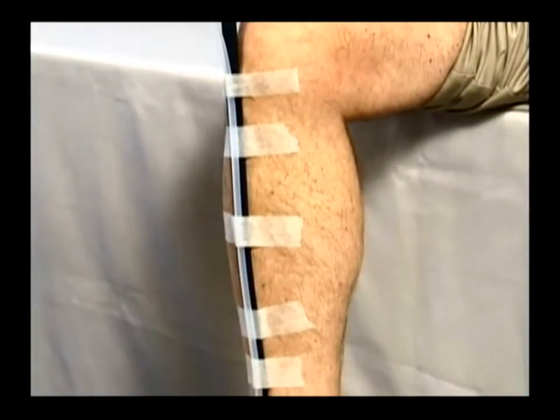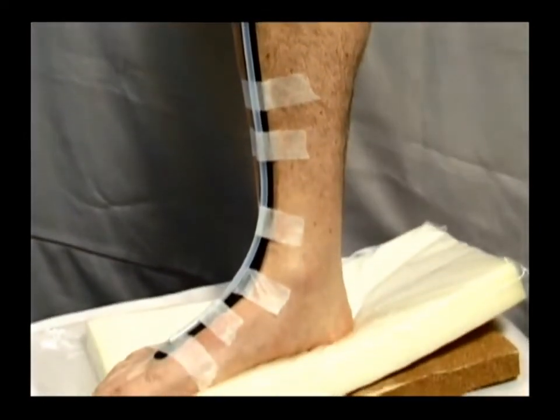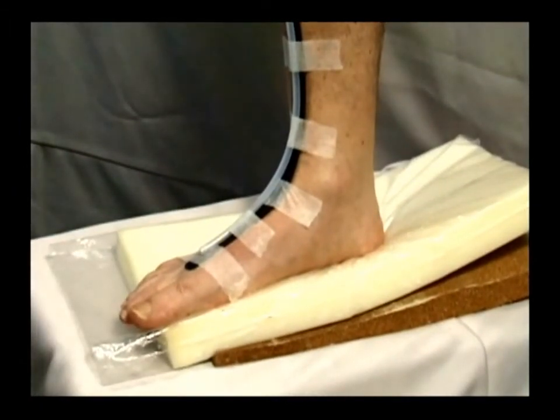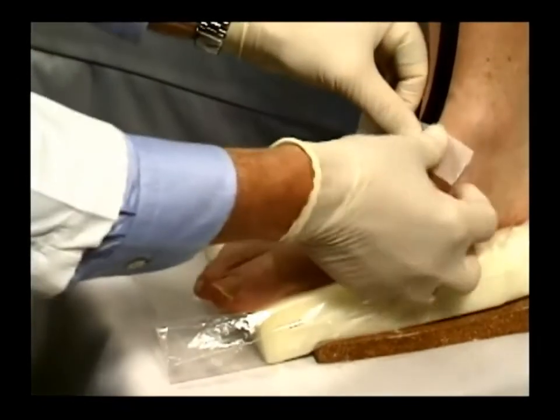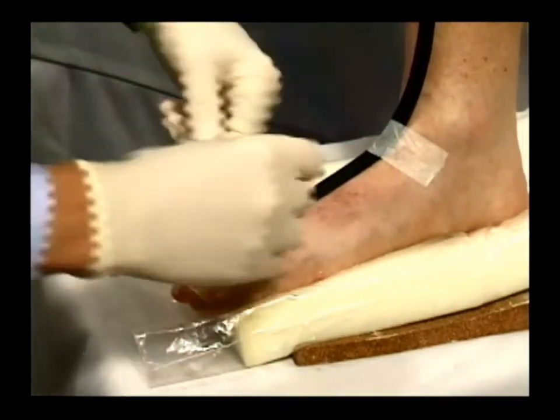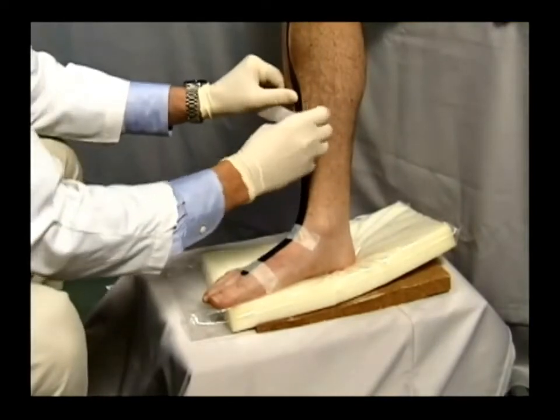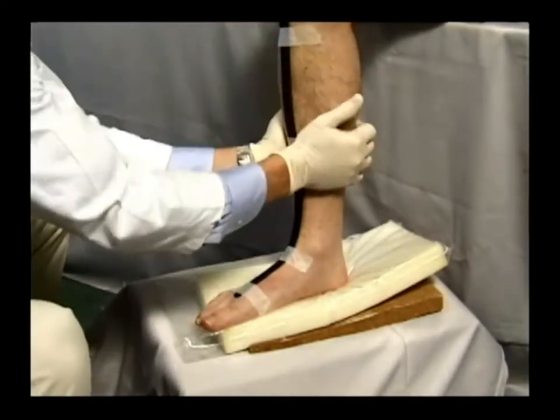Have eight to ten strips of one inch paper tape, each three inches in length, ready to use. This tape should not be too aggressive so that removal is easy. We recommend 3M's MicroPore 1 inch wide paper tape. With the 24 inch plastic strip held in the correct position, place the first piece of tape directly over the joint line of the ankle. With the strip now anchored, slightly adjust and reposition if necessary the distal end so it is one half inch directly behind the first inner space, and tape down this end with the second strip of tape. Next, place the third piece of tape halfway up the leg, aligning the plastic strip over the tibial crest. Finally, tape down the proximal end of the strip to secure it in place.